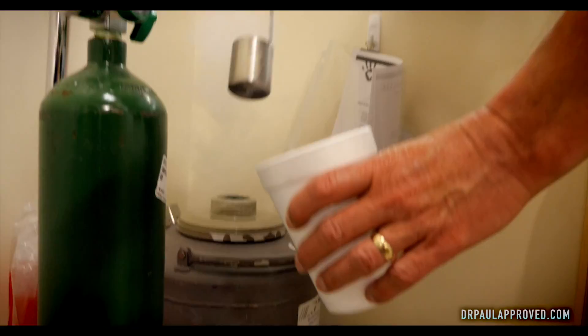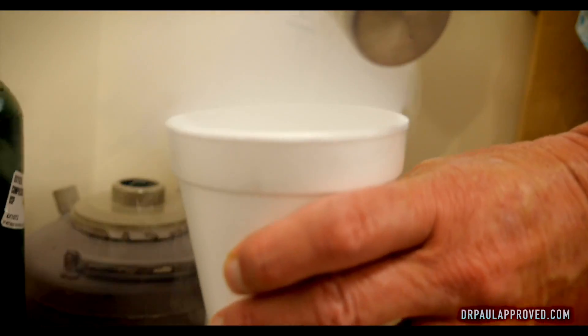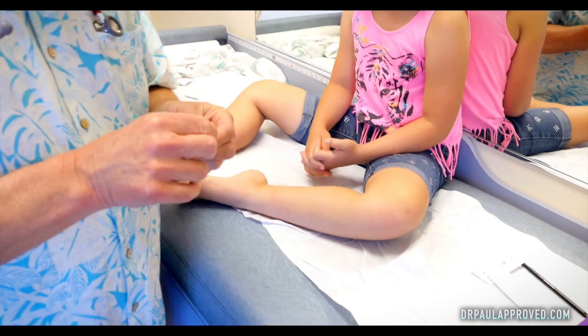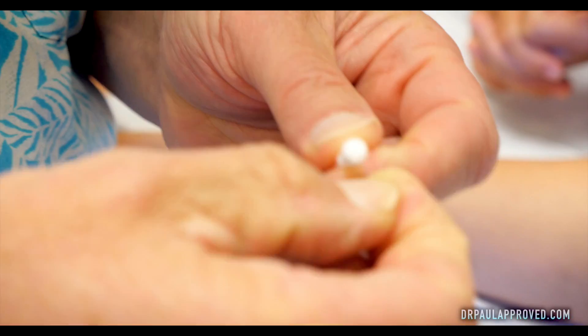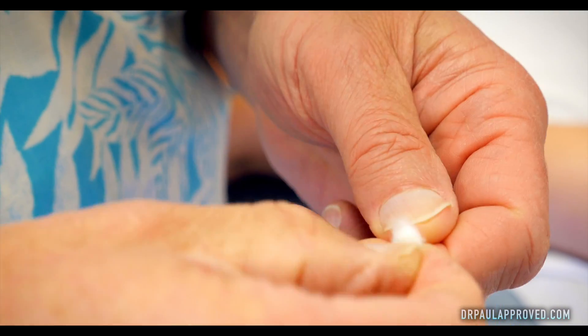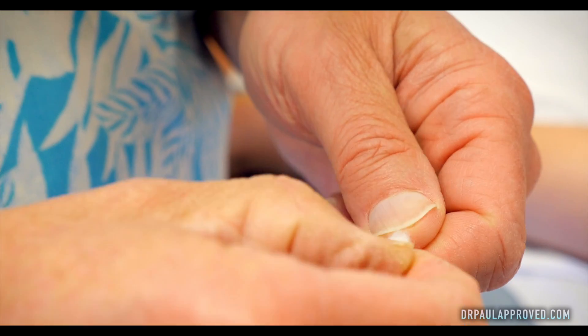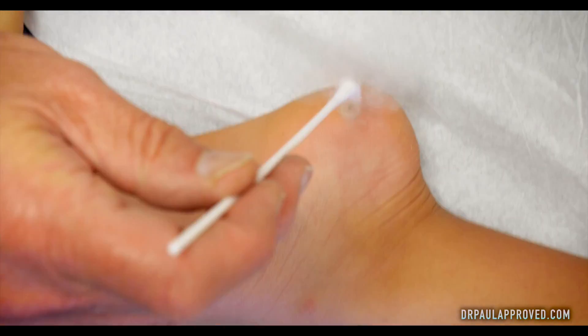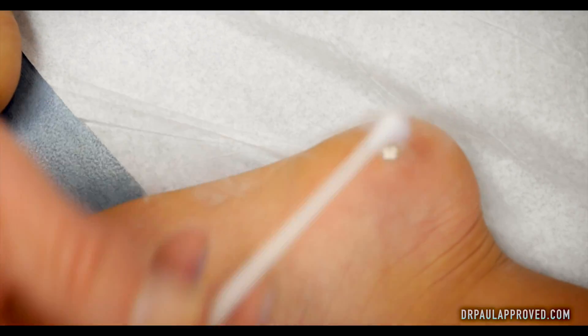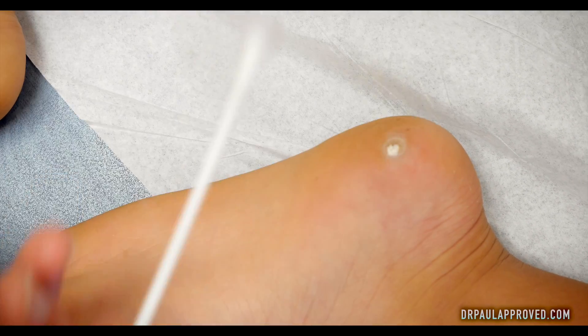What's this video missing? Liquid nitrogen. Let's go get some. So what I do for this technique is I take a regular Q-tip and I kind of make it a little softer on the end. That way it'll hold more liquid nitrogen. And then we're just going to get a little bit of that on there. Cool — isn't that cool? See how it turns white like an ice cube?